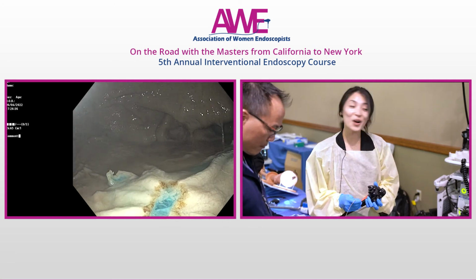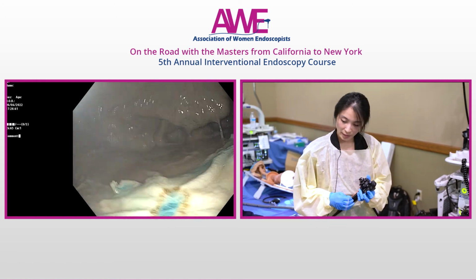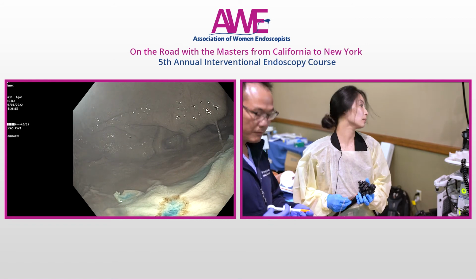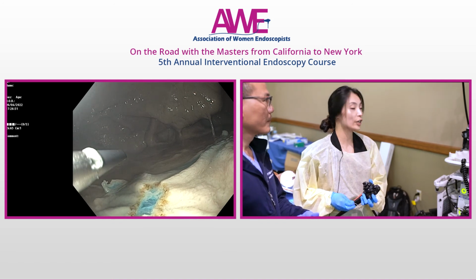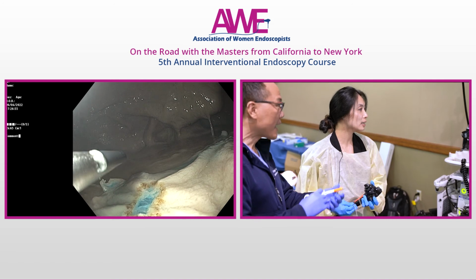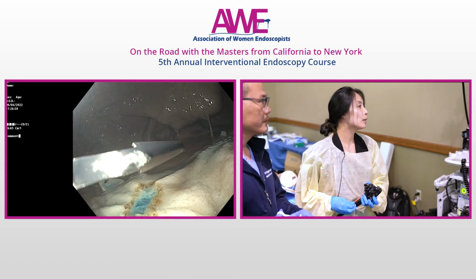And now we're going to show, oh, we're also going to clip. Okay. So this is a resolution clip. The benefit of this clip is that there is one-to-one rotation for the endoscopist, so I can rotate it however I like here. It can also be done by the assistant. So open.